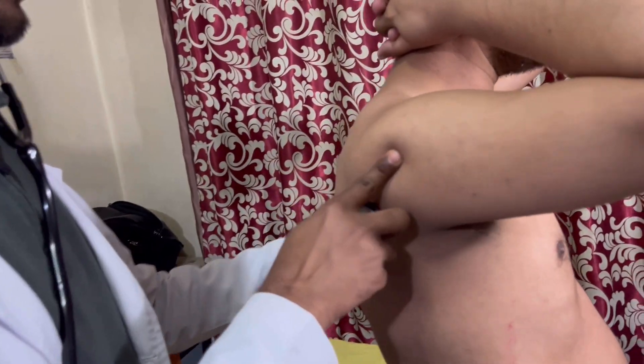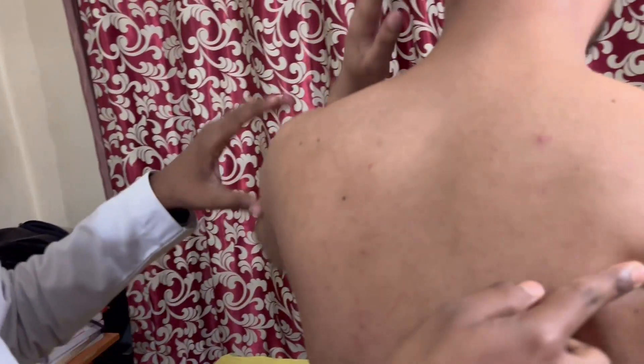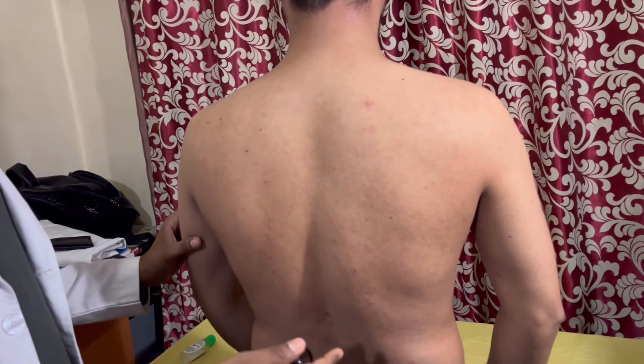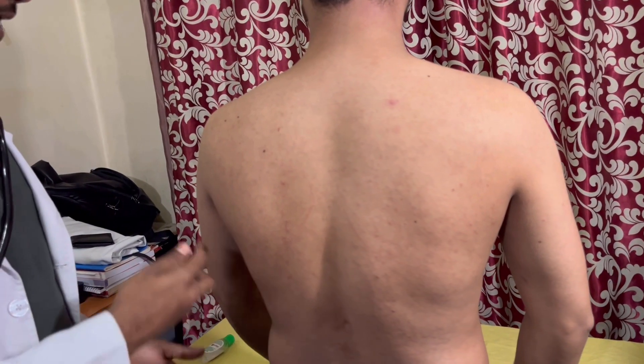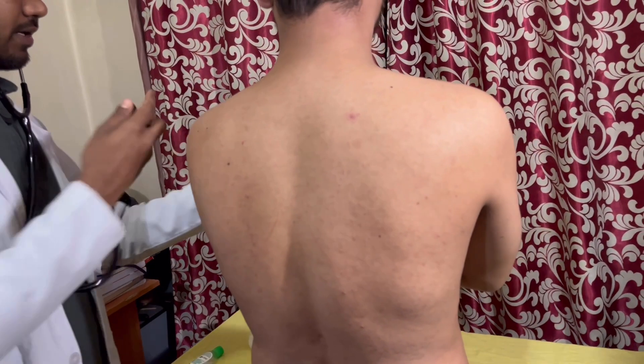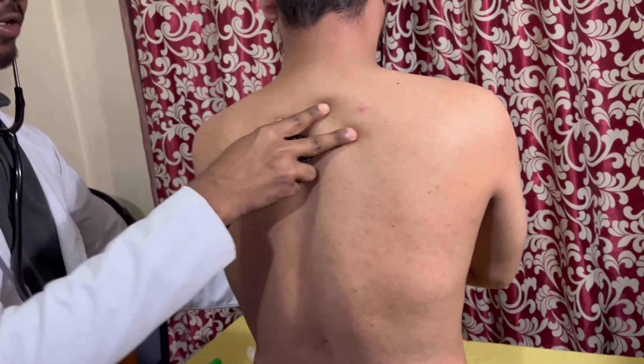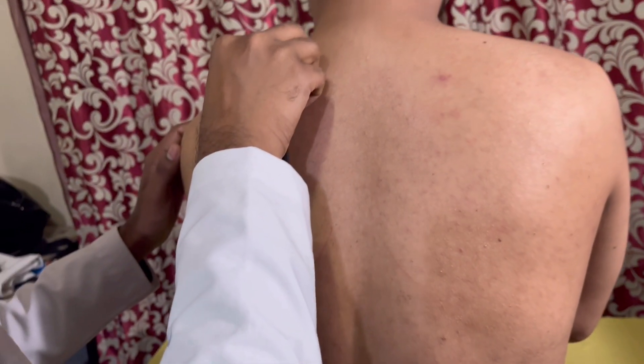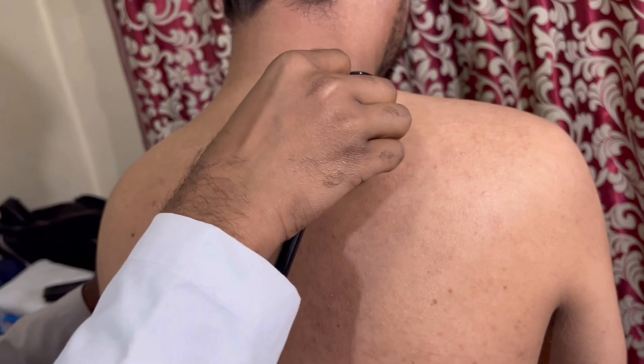Now we turn the patient for auscultation of the back. The patient's hands should be crossed and slightly leaning forward. First, we start from the right side — the suprascapular region — then the left side.